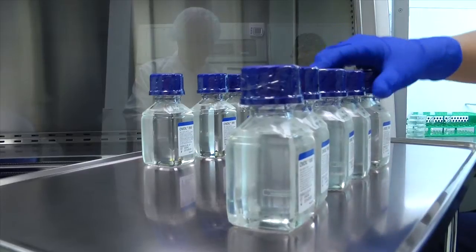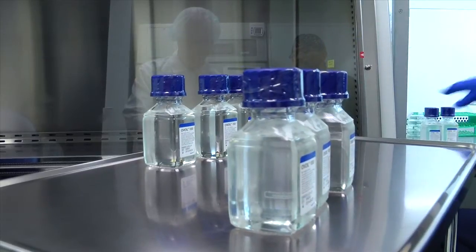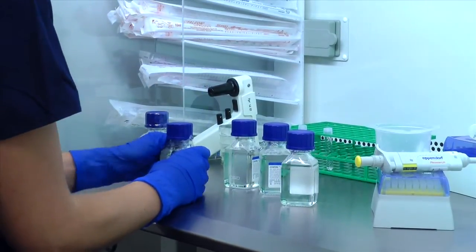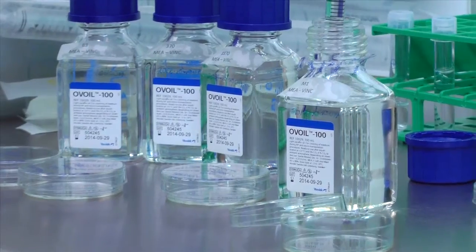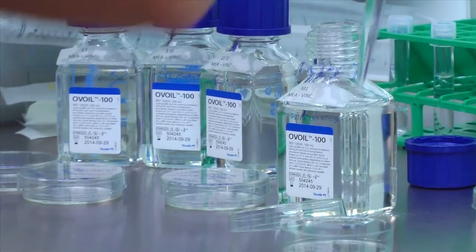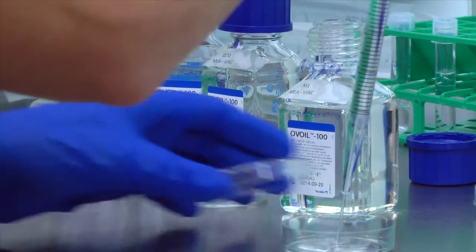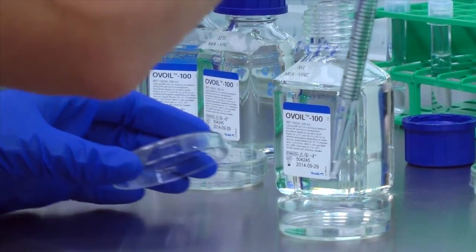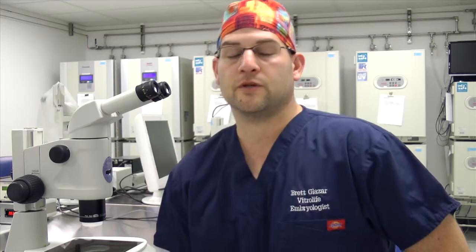The way we do MEA is to take a raw material and expose it to our simplified media and utilize that media in the culture of one-cell mouse embryos. The mouse embryos are placed into a culture environment for five days, and at that point we determine the number of blastocysts that have developed on day five. The development of blastocysts to day five is used as the criteria for release of finished products.